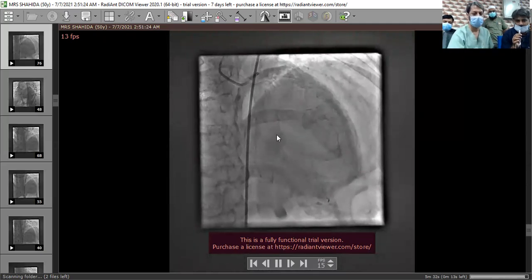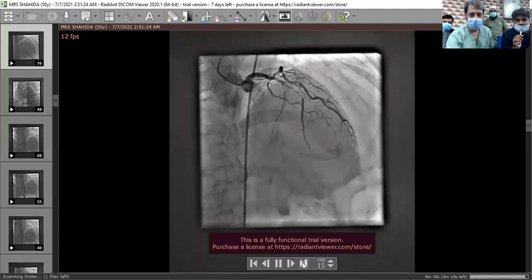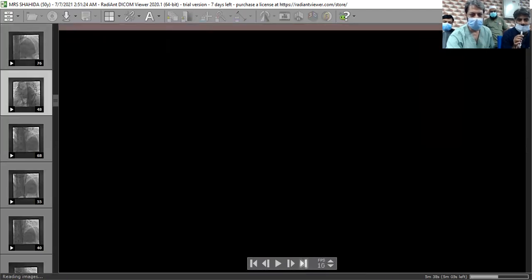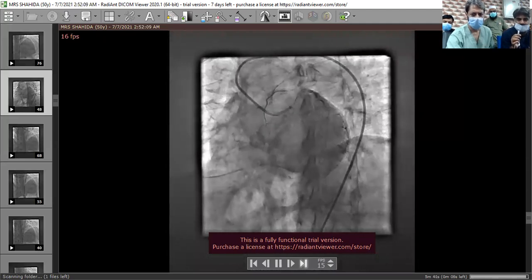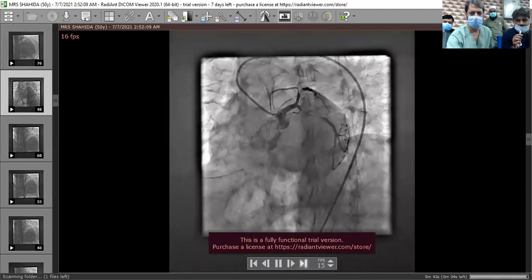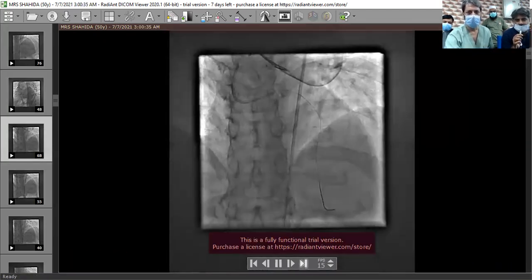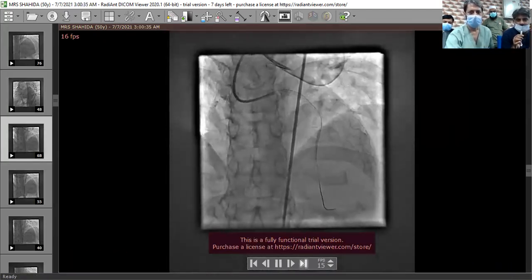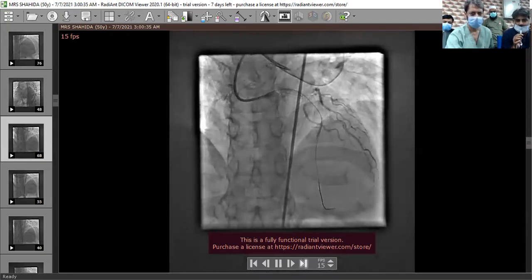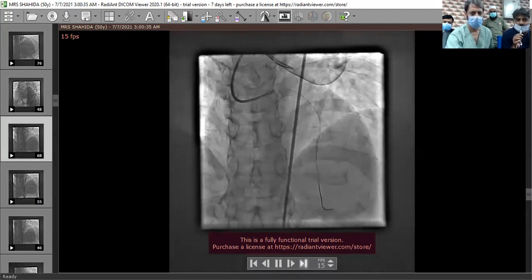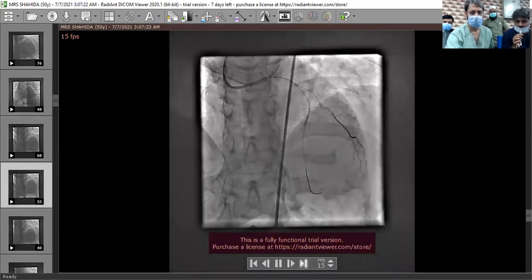It is clearly the culprit. After that, we took the guide catheter and took different shots — further views to further confirm. Severe disease in circumflex again confirmed. Then we passed the wire and pre-dilated the lesion with a 2.0 by 15 balloon.